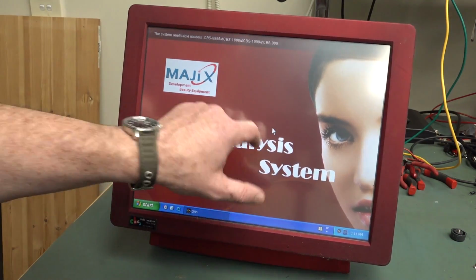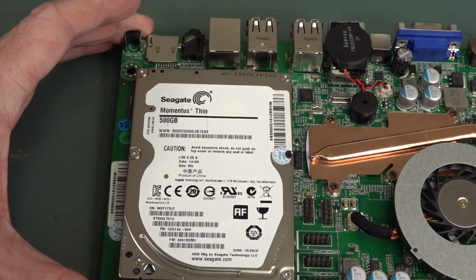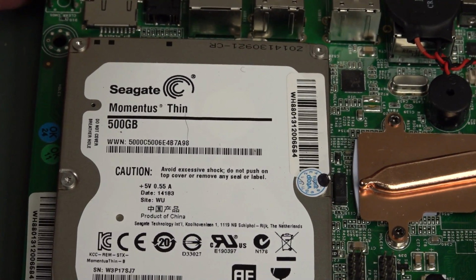Anyway, so I'm not going to muck around with that anymore. Let's just go back to the PC, shall we? And there's our single board computer. It's quite neat. And it's a Momentus thin hard drive. Check it out, the Seagate Momentus.